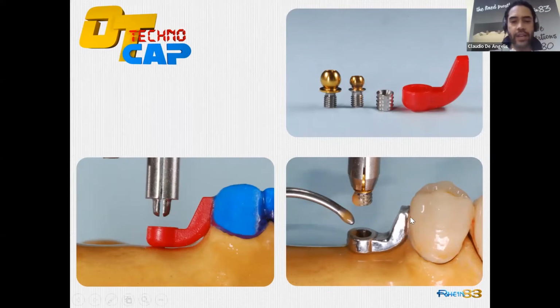Here we have a castable arm, which will be connected to the crown as before. The only difference is that I do not have a sphere here on this part of my arm. I always need to preserve the arm, the horizontal area. I need to place them in parallel between the two sides of the mouth and perpendicular to the occlusal plane.